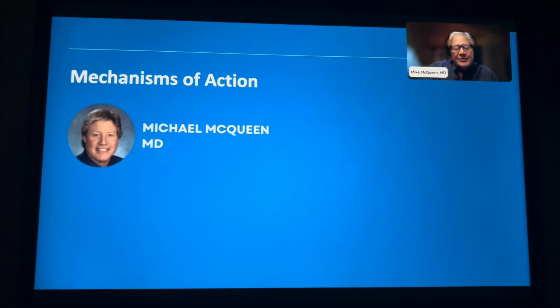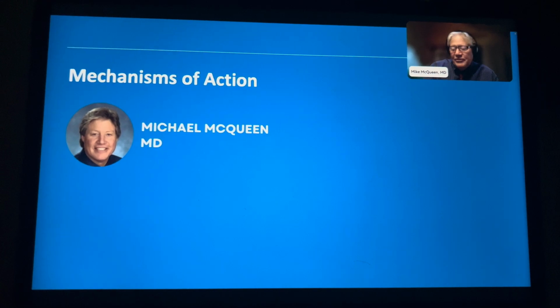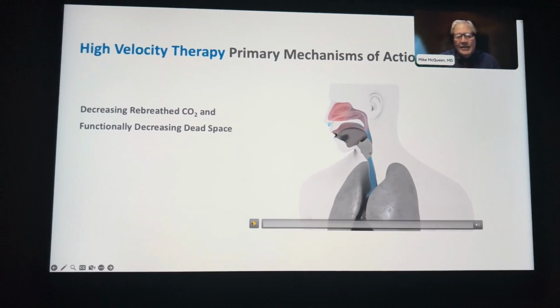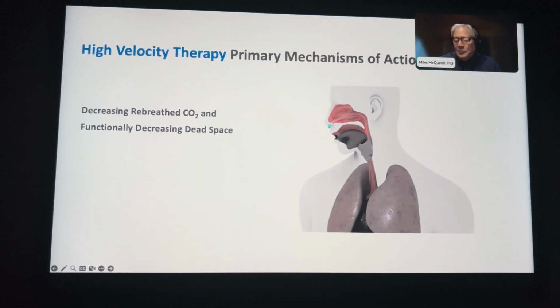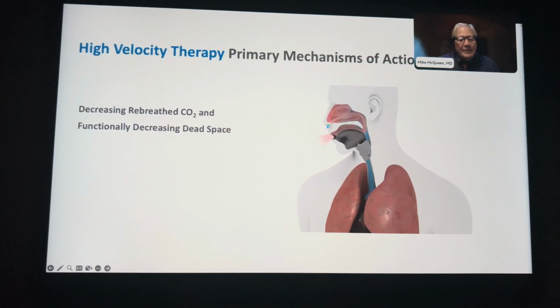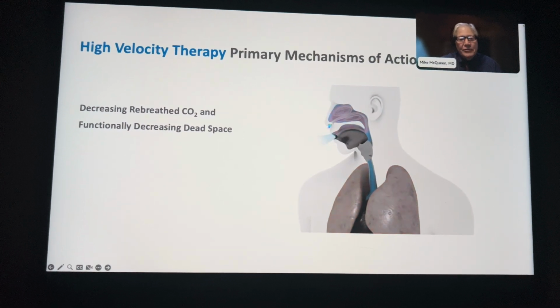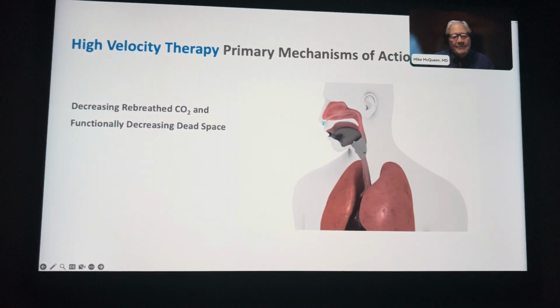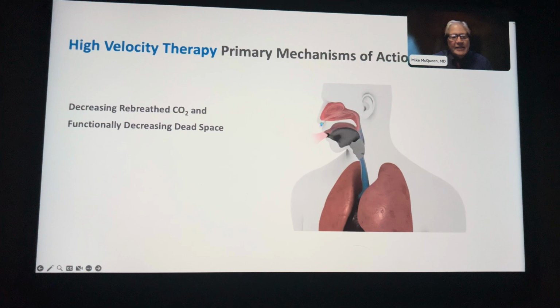Well, let's switch gears just a little bit, and I'm going to intervene briefly to talk about the mechanism of action to try to answer the question of how is this possible? How can a nasal cannula possibly provide equivalent support, relief of dyspnea? Really, I saw that happening within 30 minutes and then sustained over 4 hours, and removal of CO2 as well as a positive pressure mask.